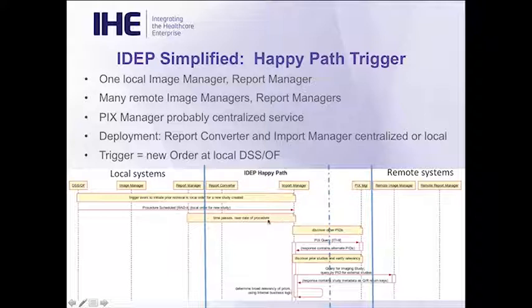Time's going to pass, and closer to the date of the procedure, our new import manager is going to go off and say, are there other patient IDs for this patient? It'll query the PIX manager, and it'll get back a response with alternate patient IDs. Then the import manager is going to attempt to discover whether or not there are additional prior studies at other remote systems.